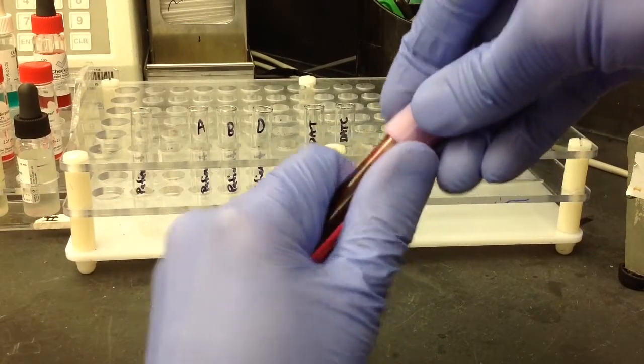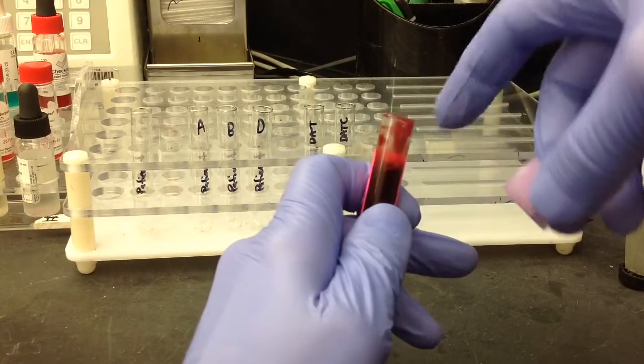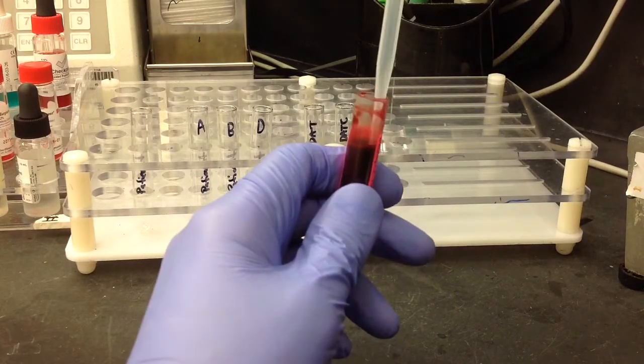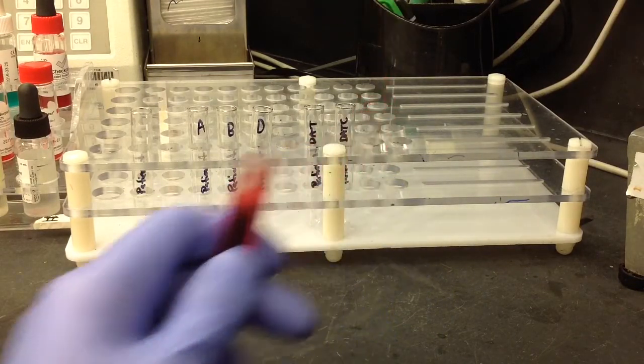When opening a cord blood specimen, they typically are clotted, and if that's the case, just be careful the clot has not stuck to the lid, as you may make a mess if you pull off the lid too fast.